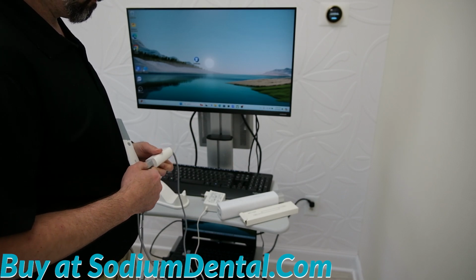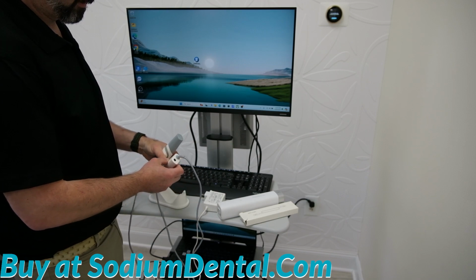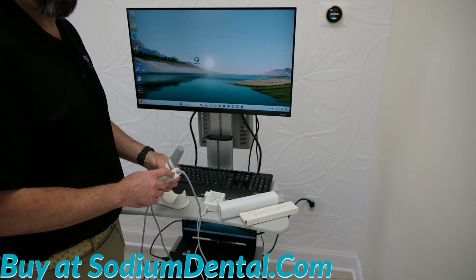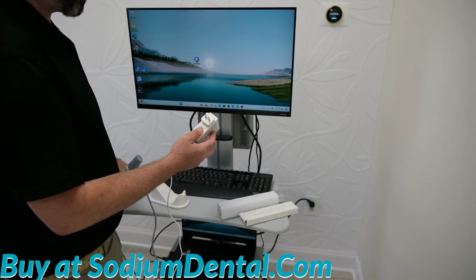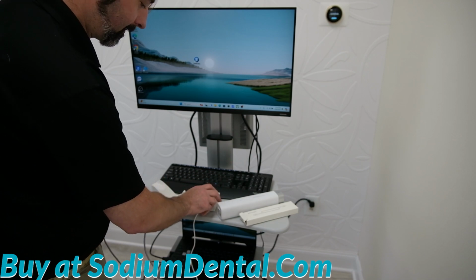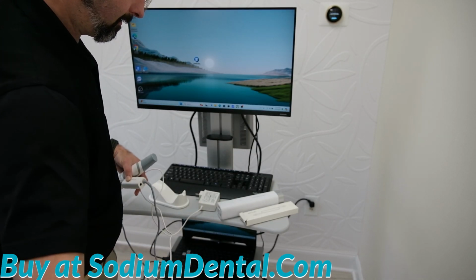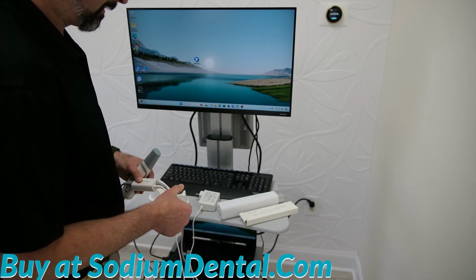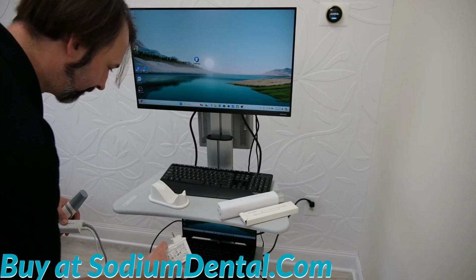Plug into here. Now you'll notice on the back of this, you have a DC in plug. This is to bring power into the device. You will have this power adapter in your kit. So you plug this into here. Now, it's important to then plug this into power.